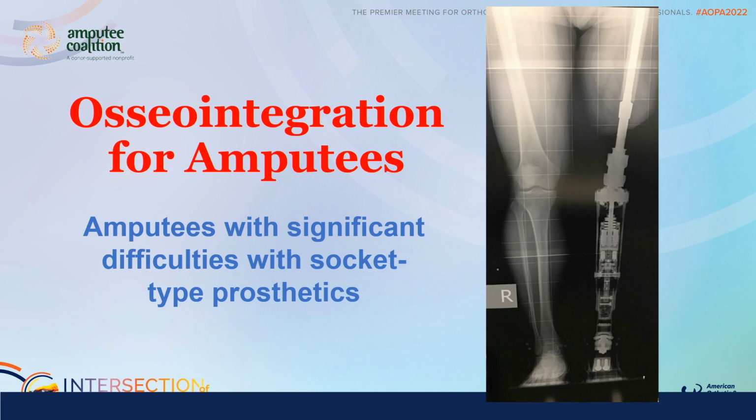Now, anybody in here ever have a patient with a difficulty with a traditional prosthetic socket? Every person here in the room. What are the problems you have? That's uncomfortable. There's a skin graft underneath there. There's pressure on a nerve. The stump is, the femur is really short. You can't get it to stay on. They sweat and it falls off. All of those things are gone.